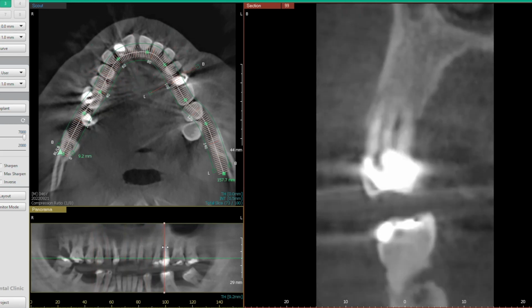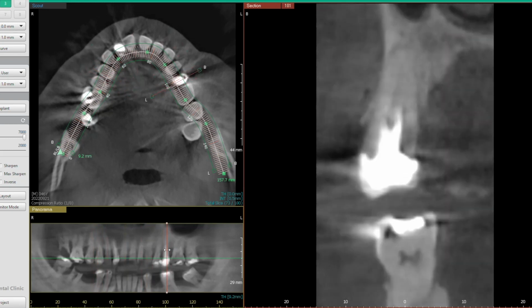And what we're seeing right now, let's take a look at the opposite side, right? So he's got a root canal on this side, no infection there. What we're looking at is the outer cheek. We're looking at the roof of the mouth, sinus, nasal cavities, and then down here, lower tooth. And then let's see right here. He's got plenty of good bone around this root. This is his root. This is the bone. This is what we want to see. We want to see the white bone.